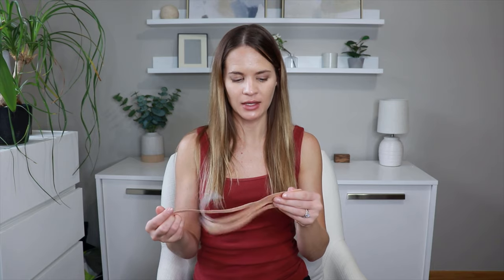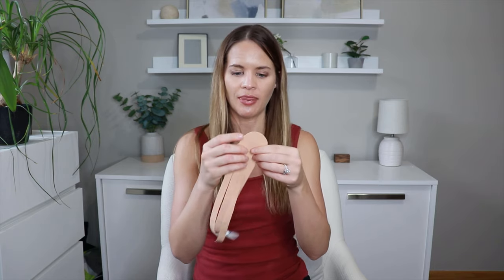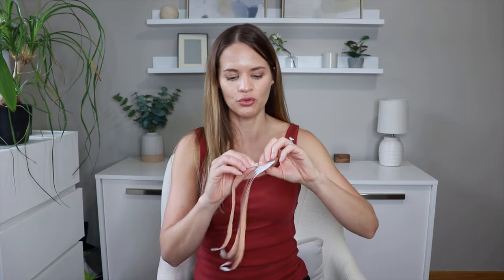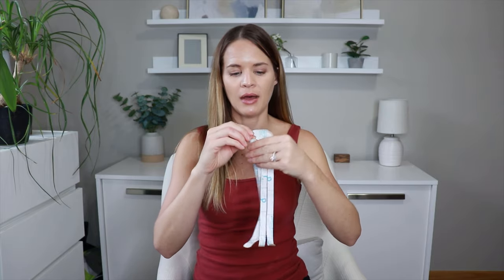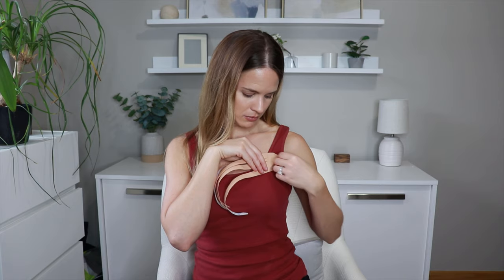Now we have our two strips ready to go. We're going to place the first one — the across strip — and the anchor side, which is the one to two inch uncut area, needs to go towards the healthy armpit or the area you're trying to move the fluid towards. I like to place it near the armpit. So we're going to rip off the back paper, peel back that anchor piece, and go near the armpit — not in the armpit, just near it — and then rub it down. Rubbing it activates the adhesive with warmth so it sticks better.